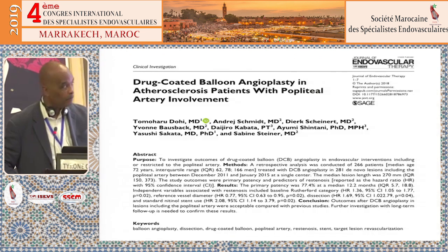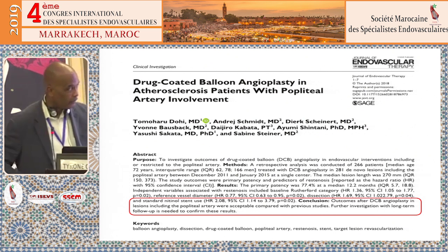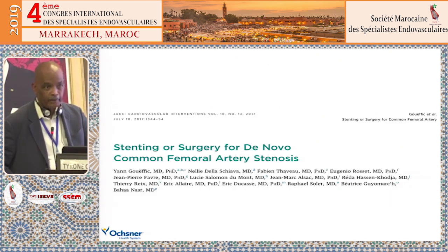interventional procedures. Now, we have to keep in mind that we now have another technology called drug-coated balloon angioplasty, and this is something that's being used in the popliteal region. And it may turn out that this might be a better choice than putting a stent, but certainly for patients that have dissection or have other heavily calcified lesions, we don't know what the data is going to show long-term.